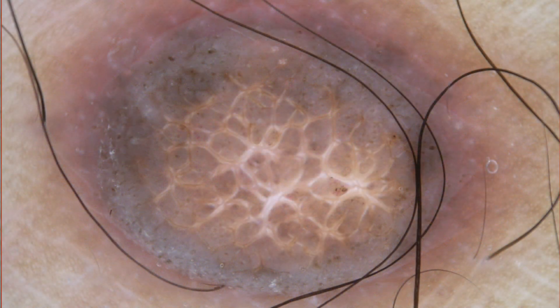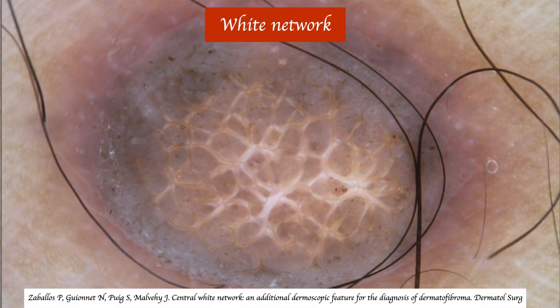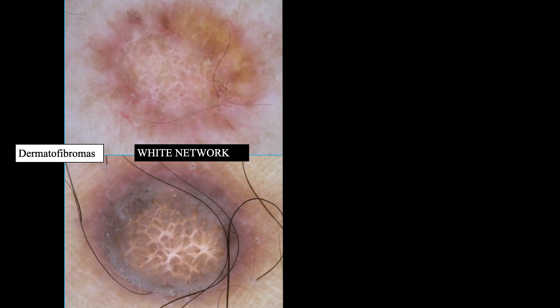Returning to the typical pattern, instead of the white scar-like patch, we can observe this structure which has been called white network. This structure is composed of white lines and brown holes and is considered a variation of the classic white scar-like patch because the histopathologic correlation is similar.